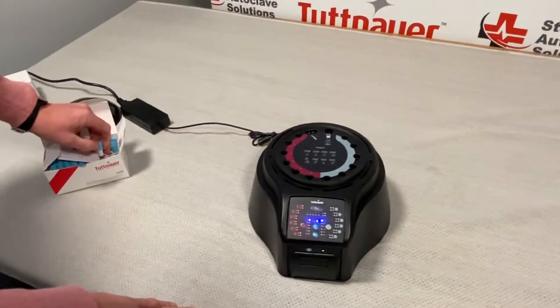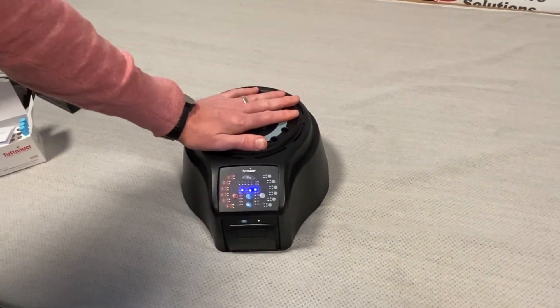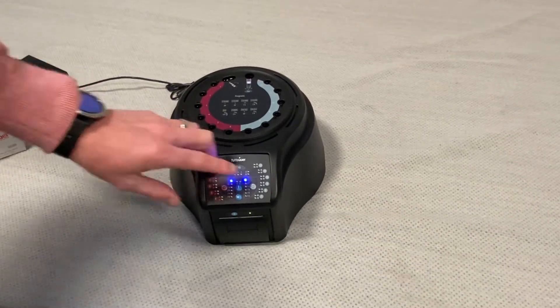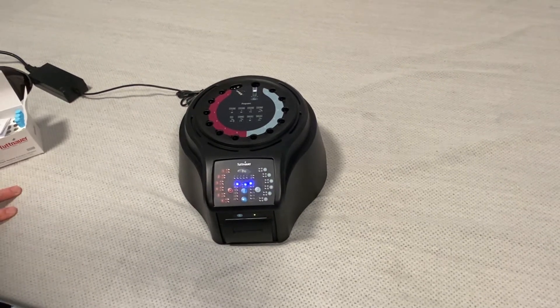These are very simple to use. Once the machine is on and running, as you can see, this machine is technically still heating up — this little blue light is going to flash. Once that blue light is solid, the machine will be ready to go.